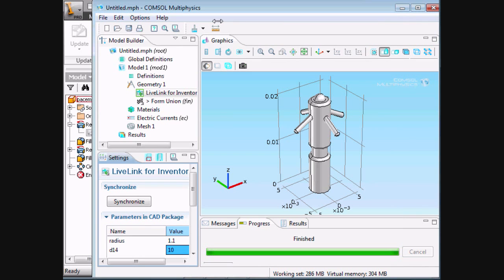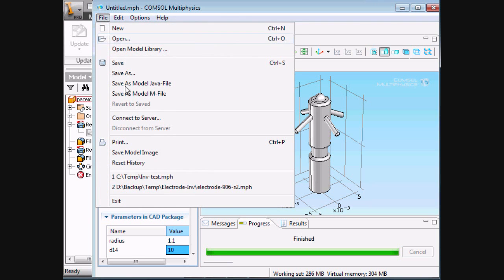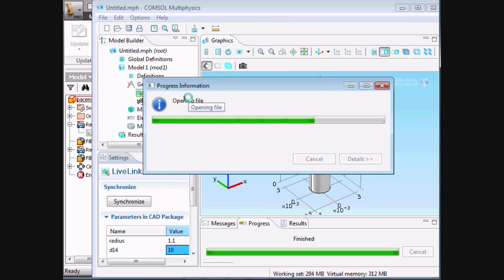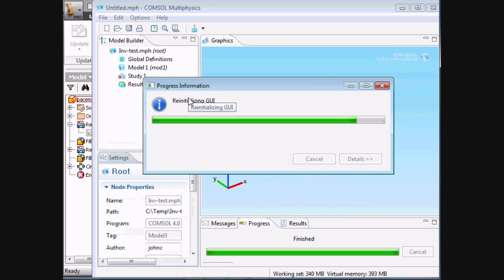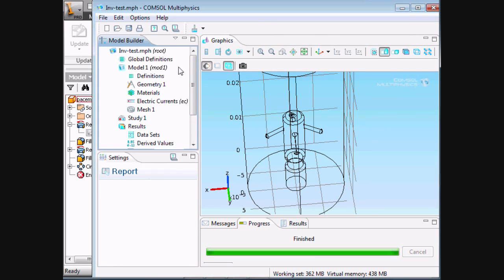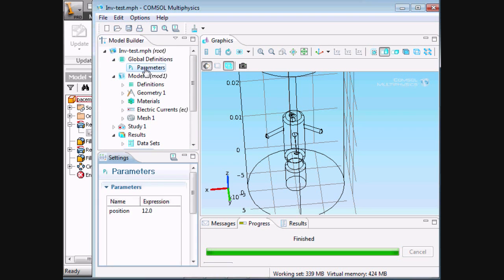Now that I've shown you the Synchronize feature and how to use the parameters to update the CAD model, let me show you how to use it with a Parametric Sweep. I'm going to open up a new project which continues on from this model. This is a project that uses the same CAD model, but we've added all the other aspects of the project, including a global definition of a parameter.